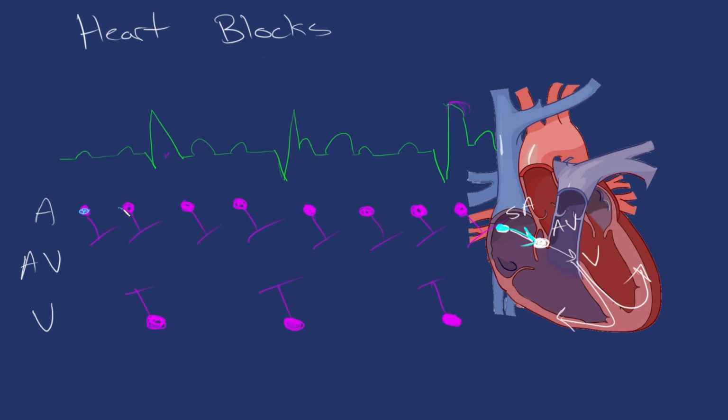If we were to measure these out, each of them would have the same distance, so there would be an atrial rate of, we'll say, 150. But it's only related to itself. The PRs don't match up anywhere in here. And the ventricles, if we were to march them out, we'll say they have a rate of, say, 40, and they would be related only to each other. So there's no relation between the P's and the QRS's.